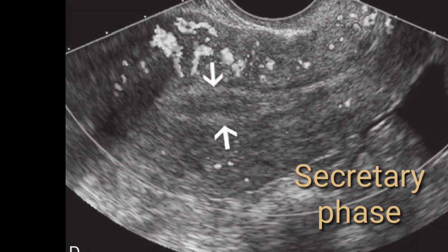So you can see there is visible thickening of the endometrium. In the secretory phase, there is secretory activity going on. That's why it is called the secretory phase. Normally the menstrual cycle is divided into three phases: proliferative, secretory and menstrual. In the proliferative phase we have discussed the thickening, which could be from 6 to 10, and in the secretory phase it should be from 12 onward to 22. It varies from individual to individual, and also depends upon the hormonal secretions.